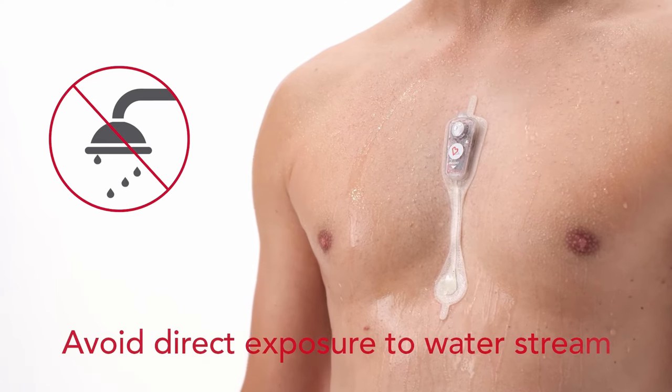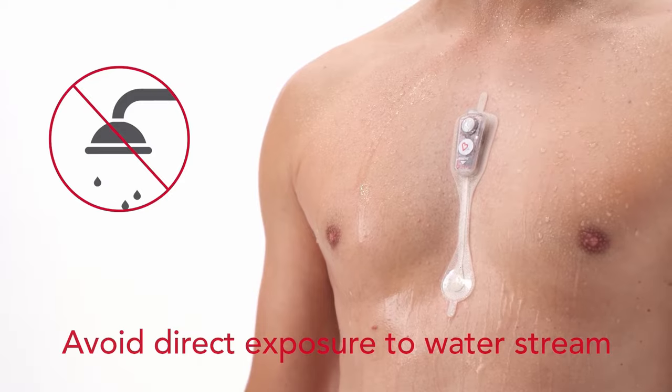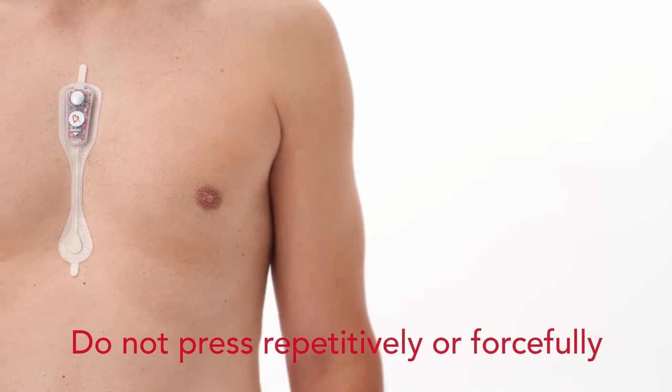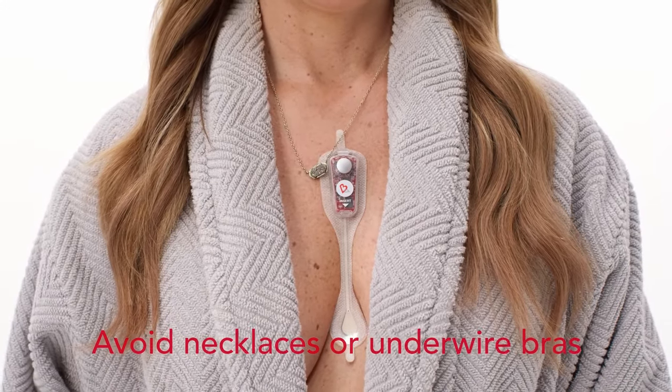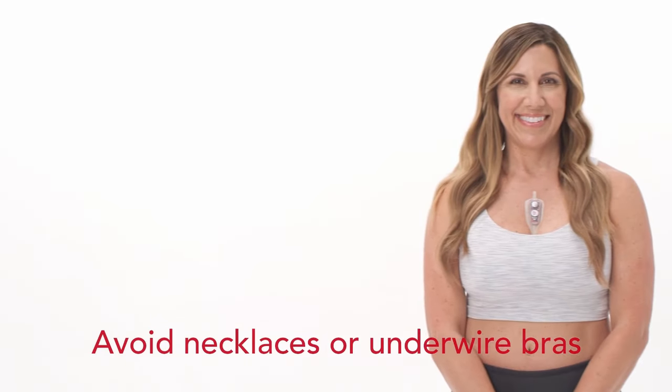When showering, avoid exposing the monitor directly to the water stream. Do not press the event button repetitively or forcefully. Avoid wearing necklaces or underwire bras as these can disrupt recording. Sports bras or no bras are recommended during wear.